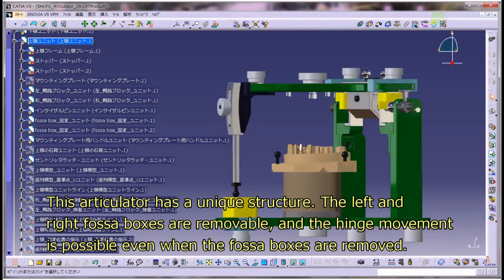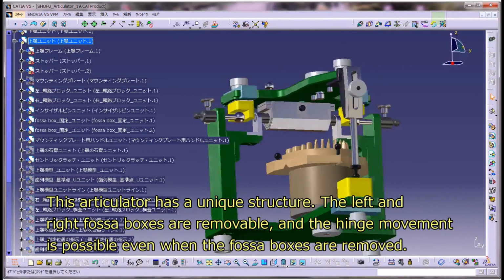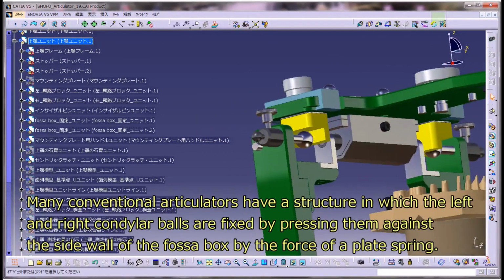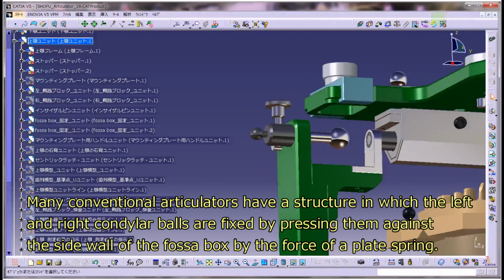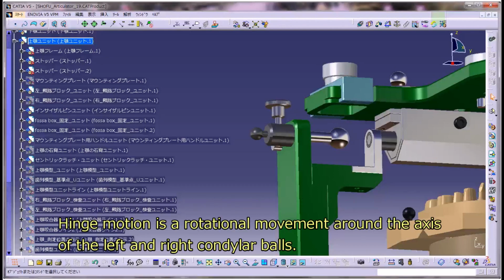This articulator has a unique structure. The left and right fossa boxes are removable, and the hinge movement is possible even when the fossa boxes are removed. Many conventional articulators have a structure in which the left and right condylar balls are fixed by pressing them against the side wall of the fossa box by the force of a plate spring. The new articulator has a unique structure that allows for hinge movement even when removed, as the fossa box is removable. Hinge motion is a rotational movement around the axis of the left and right condylar balls.